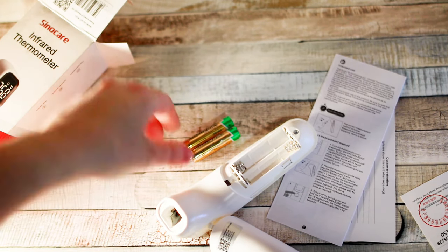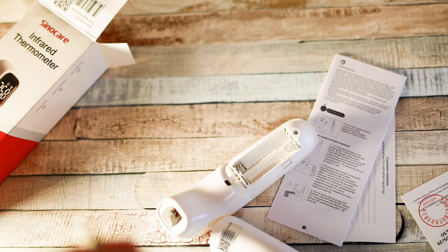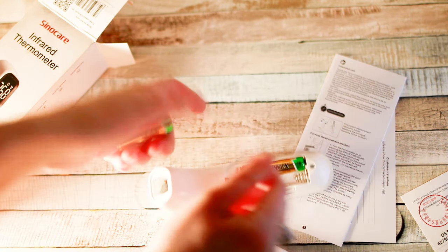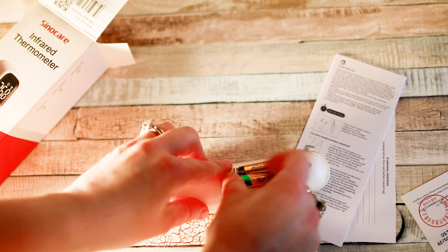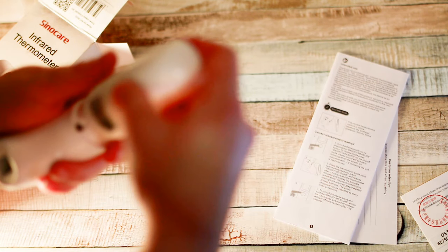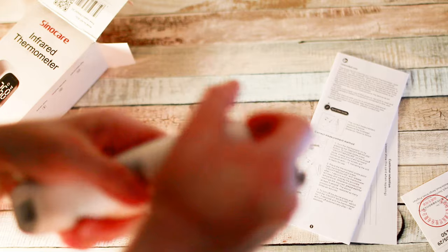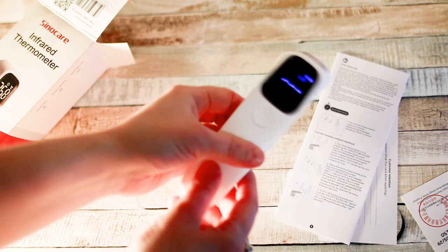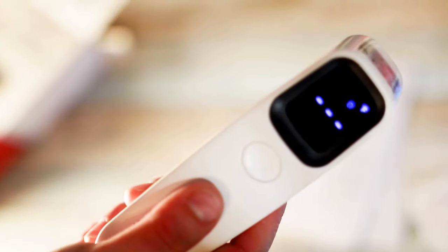Probably the most difficult part of this process is getting these batteries out of the plastic, which is already pretty much done. Alright, so batteries are out. They went in no problem — I can hear it already kind of switched on.